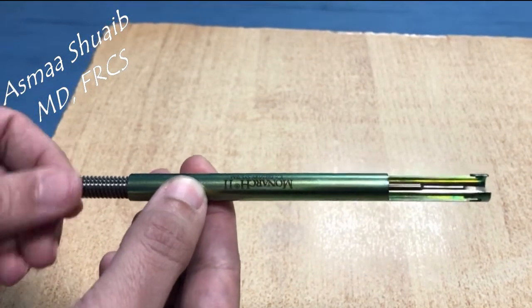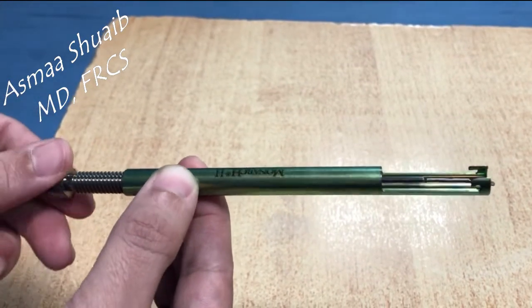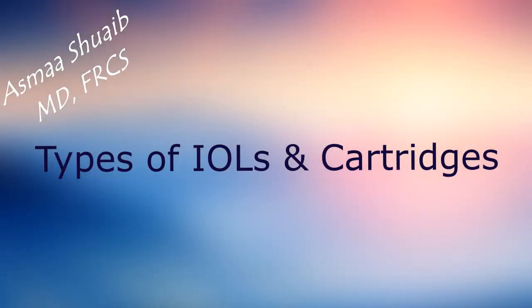The metal injector of a three-piece IOL has a plunger that has to be pushed first and then screwed to get the IOL out of the cartridge. There are two types of IOLs and cartridges that will be covered in this video.